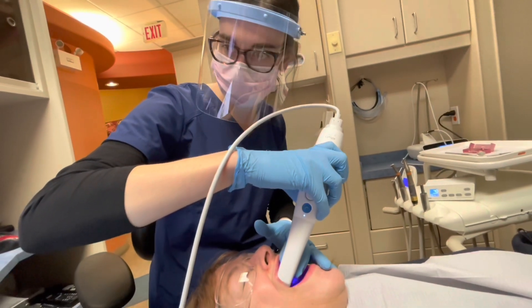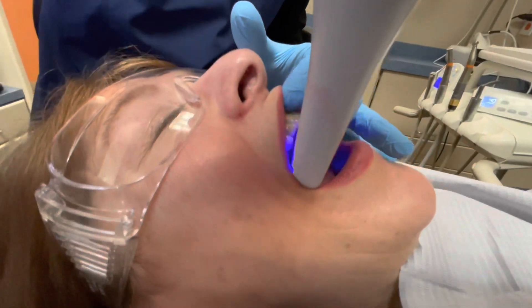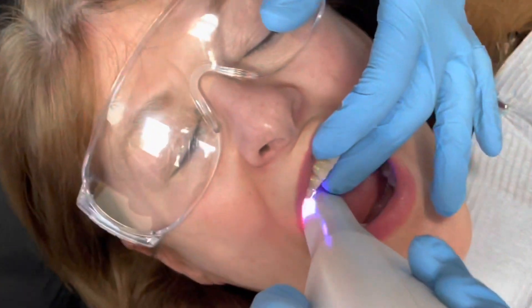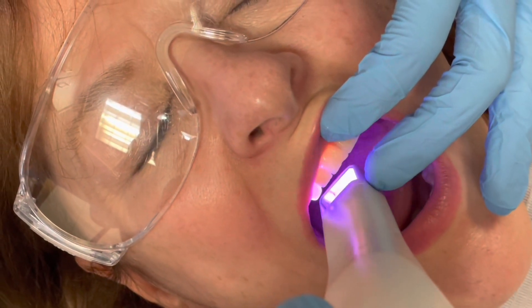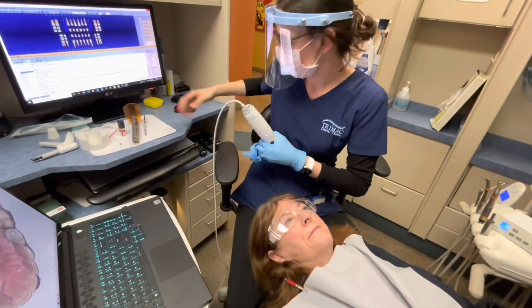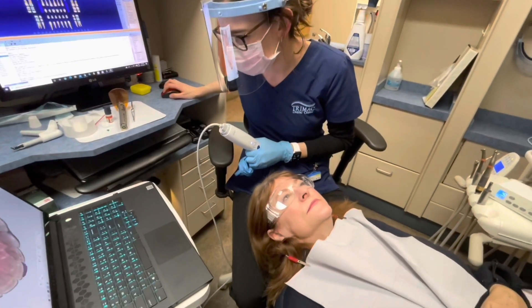This was something I got frustrated with one of the other scanners. You can see the scanner is taking a number of images — you actually have to have the overhead light off when you're scanning. She's just scanning that one area on this side and then an area on the other side, which is really less than a couple of minutes.